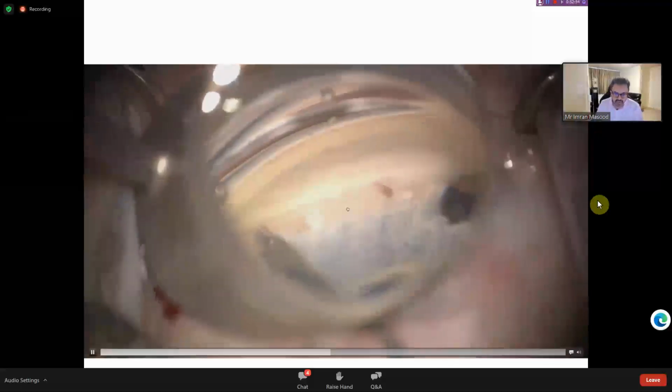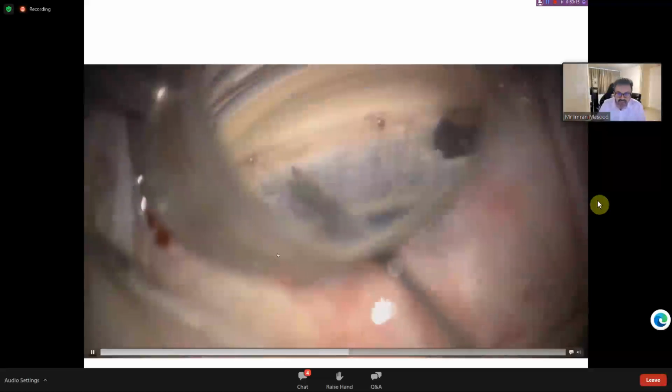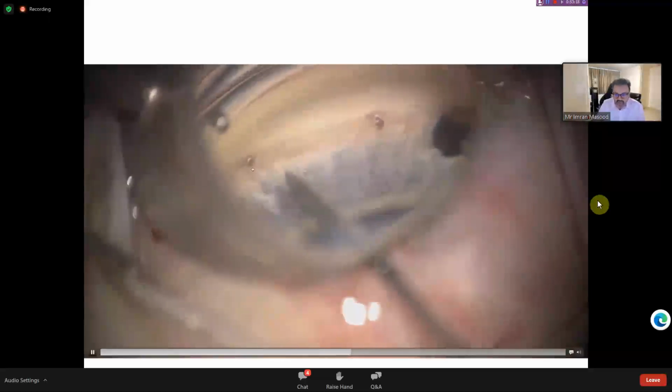And you can see there blood beginning to reflux right through the inlet of the stent, which is a really good sign. And that tells you again that despite this eye having had 3 trabeculectomies, and you might say, well, I think the angle function would be totally damaged and you wouldn't see any sort of reflux, you do get this reflux. You're getting a little bit of blood accumulating around the stent here, and I'm just going to manipulate the stent so that I'm happy it's in the right place. And there you go, you've got some blood coming out there as well.